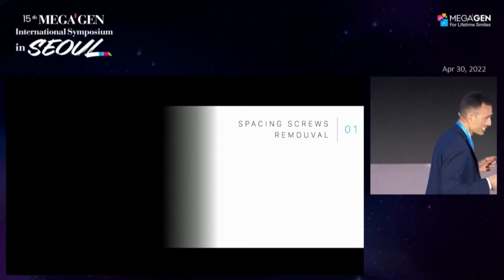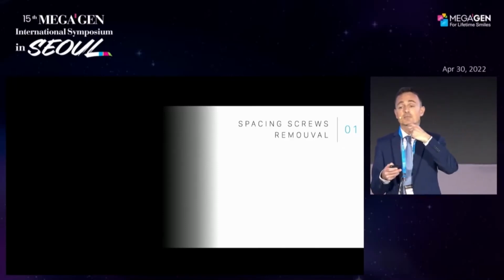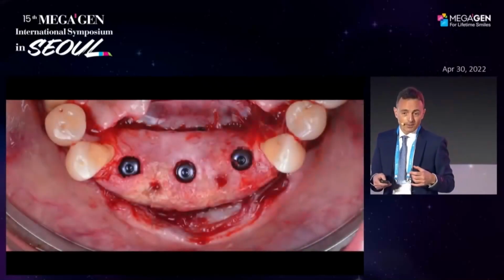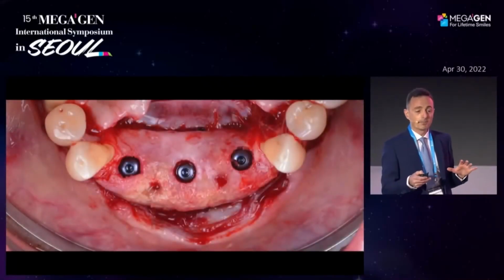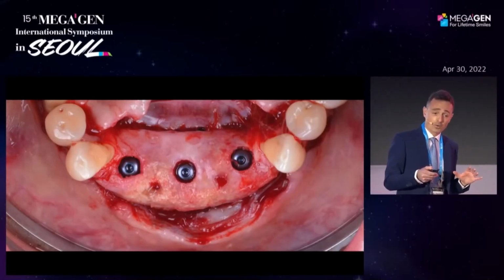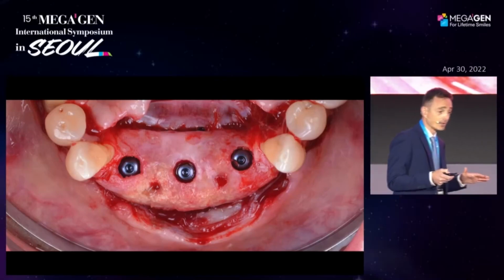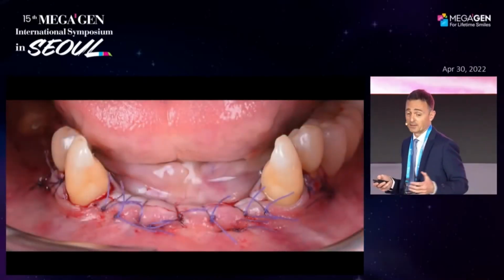You don't have to forget also that we will place the tip of the implant directly in the hardest bone that we have in our body. So this is the clinical situation before closing the wound, and you can see how I love to place the implant under the crestal bone, at least 2 or 3 millimeters, as shown before by the colleagues.